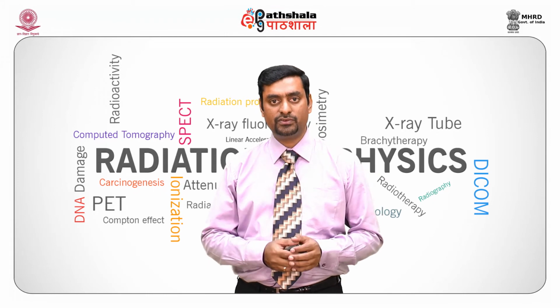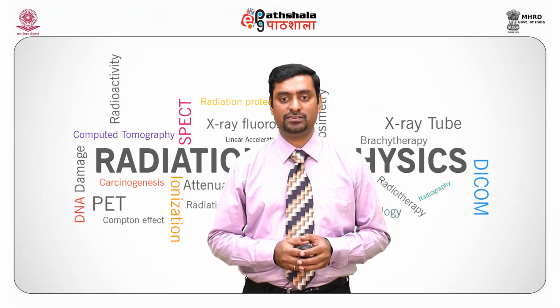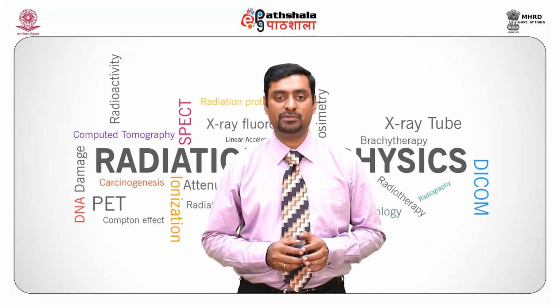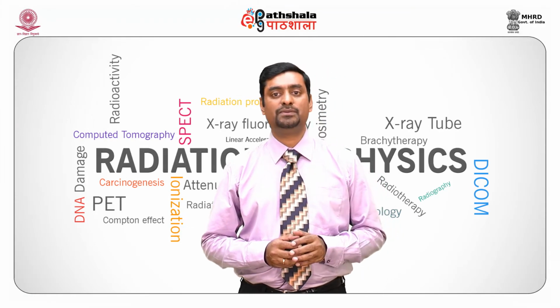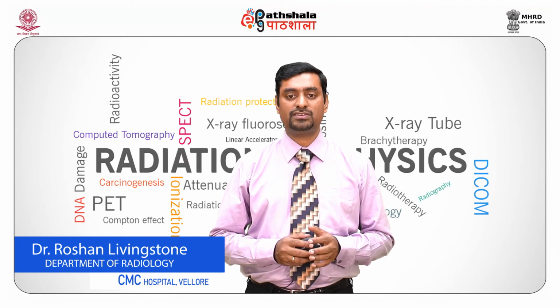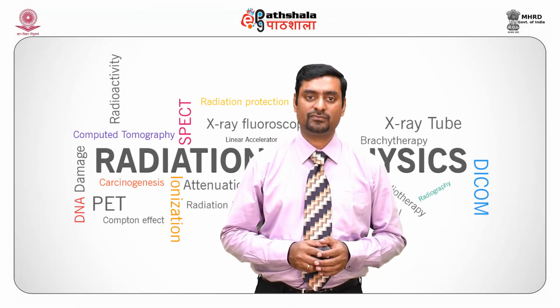In the current scenario, what we see in mammography machines with indirect flat panel detectors is a single field of view of 19 by 23 centimeter. It has about 100 microns detector element size, and produces good contrast resolution and reasonable spatial resolution.